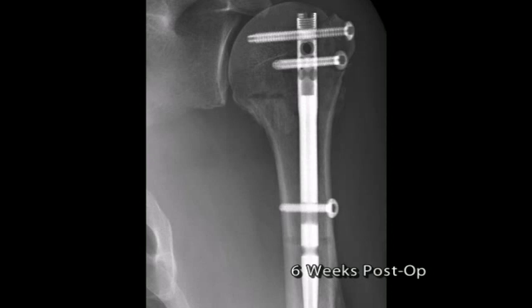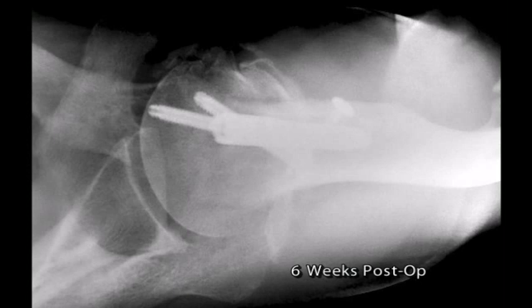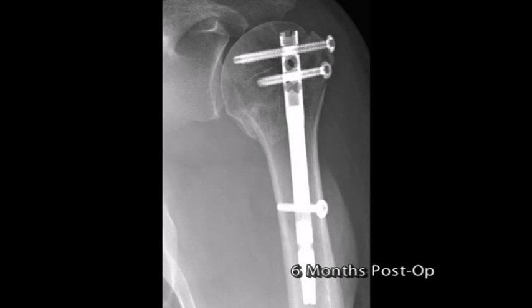This is a clear advantage of intramedullary fixation over other types of fixation in the treatment of these fractures. The six-week post-operative radiographs show the surgical neck portion of the fracture between the shaft, humeral head, and greater tuberosity to be healed with evident corticocancellous remodeling. The greater and lesser tuberosities are noted to be healed in near anatomic position. At six months post-operative, there is no evident complication, arthritis, collapse, hardware protrusion, or avascular necrosis.